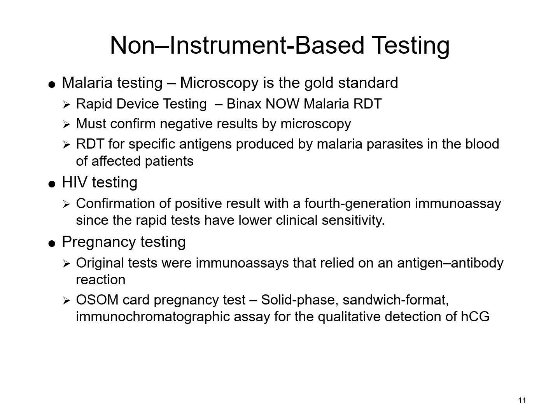Most of us are very familiar with pregnancy tests. This is going to be one of the first tests that you may have encountered. Most people are pretty familiar with these rapid tests because about everybody's had a COVID test, or at least is familiar with the over-the-counter COVID testing.